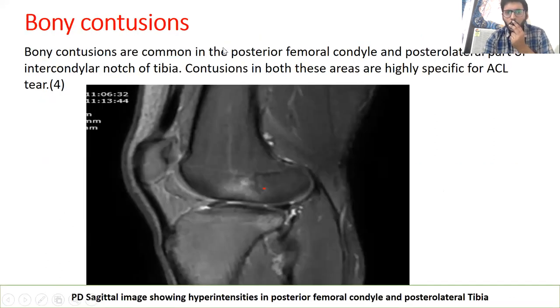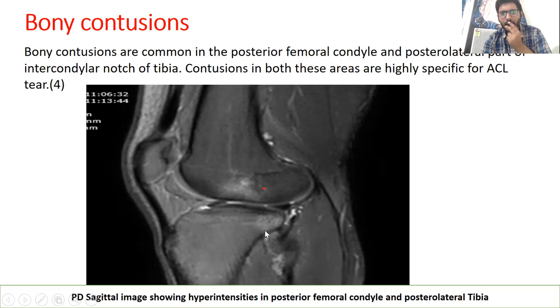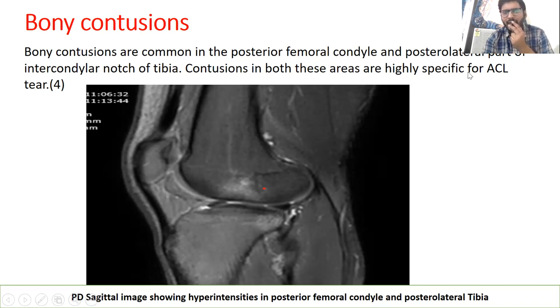Bony contusions are most common in the posterior femoral condyle and the posterior lateral aspect of the intercondylar notch of the tibia. Contusions in both these areas are highly specific for ACL tear.